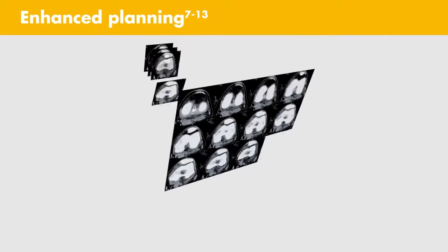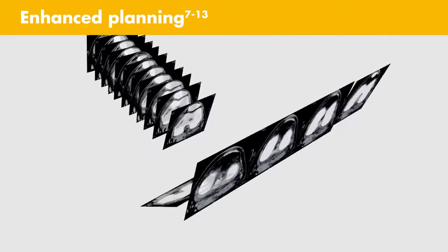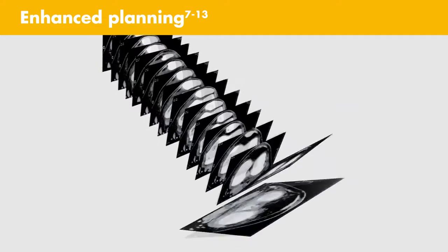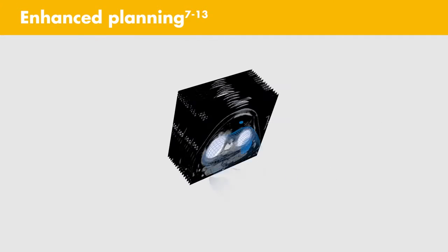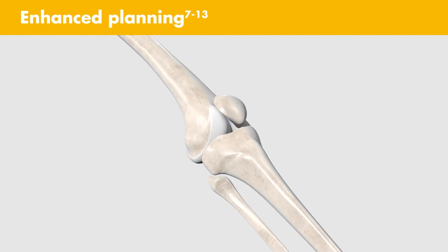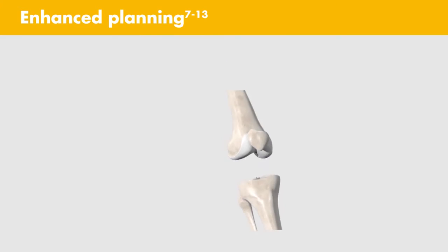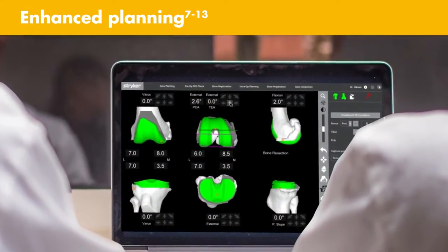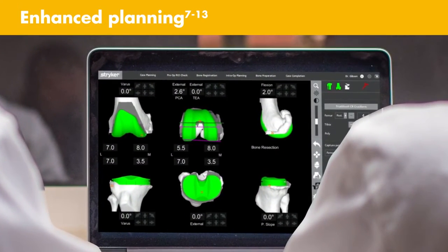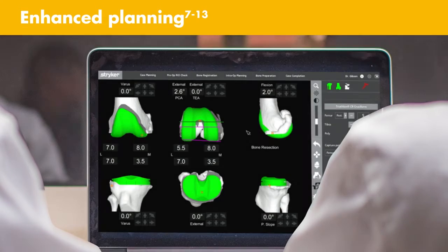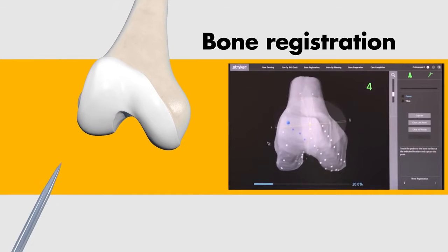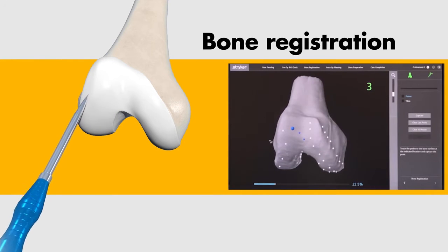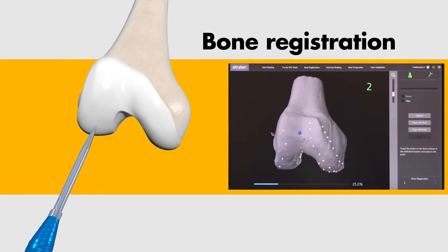With enhanced planning, CT data is segmented to create a 3D model of the patient's bony anatomy. The Mako Total Knee application allows you to position the Triathlon implant on your patient's virtual anatomy prior to the procedure. This patient-specific preoperative plan enables more accurate implant positioning during surgery, and bone registration and verification are designed to align the 3D model with your patient's knee.